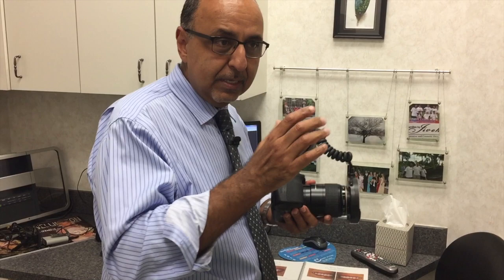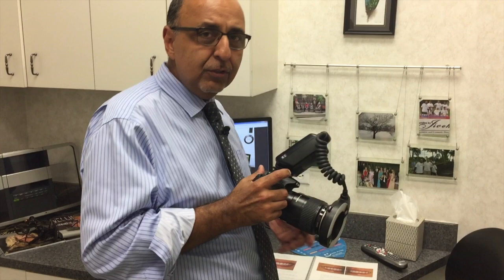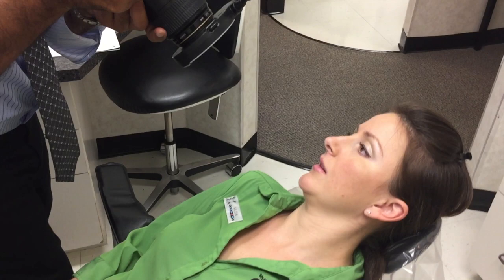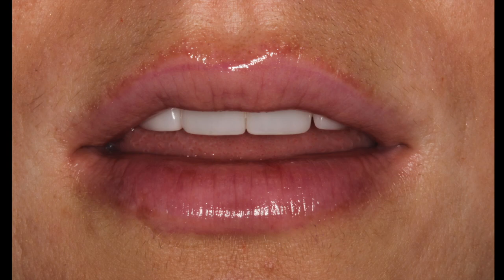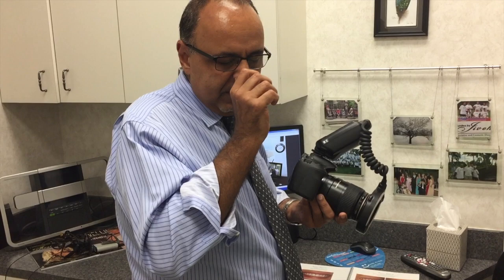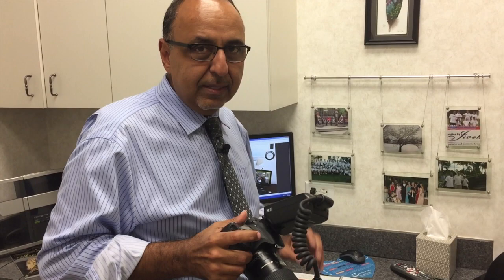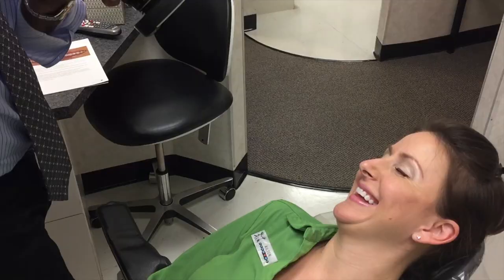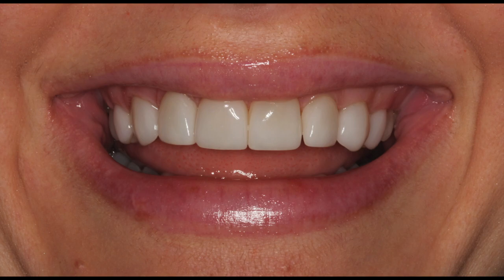Try to frame the entire lip. If you look at the photos they may show a smile rather than lip at rest, but it's okay. Try to get the commissures of the lips in your photo. You don't want to crop later — you can and we will most of the time — but try to capture from corner to corner of the lip. Then the next shot is a smile shot: same thing but have the patient laugh.